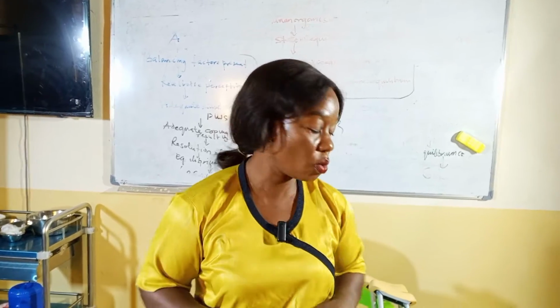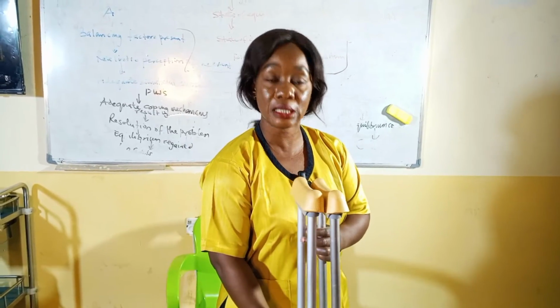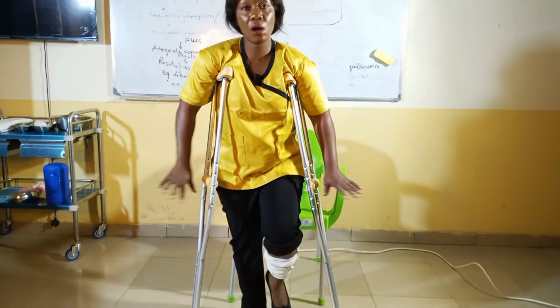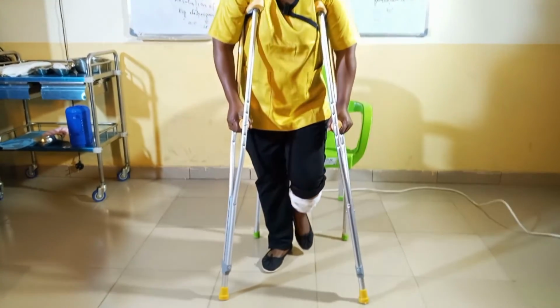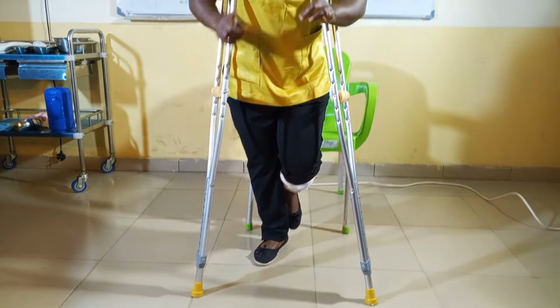Off the ground. So for this video, I'm going to concentrate on no weight bearing, right? Now, after achieving this, let's use the crutches. You ask the patient to hold. For example, remember we are doing no weight at all. So the affected limb is going to be off the ground, off the floor completely, and then ask the patient to push the crutches forward according to the patient's step, not too wide, right?